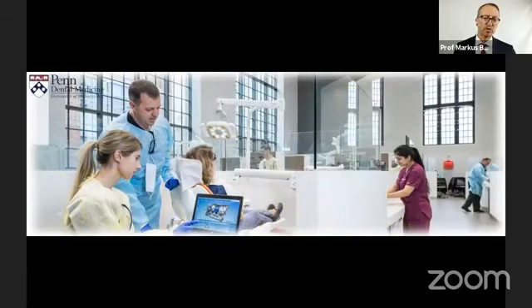As I mentioned, at the University of Pennsylvania, where I am chairing the restorative department, we have implemented these technologies quite a bit to teach our students the latest technologies and also make them ready for the practice of today. You can see we just opened a chairside laboratory where we teach our students how to mill these restorations if they want to do that in their offices, and then also finish them if they need a furnace or if they need to polish them, and how they finish those restorations.